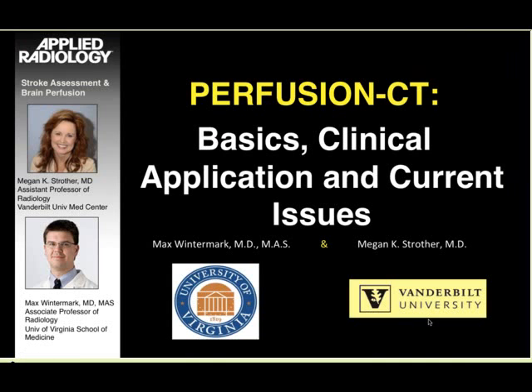There's much debate about imaging stroke. Dr. Wintermark and I could and may argue about the pros and cons of CT over MR, the reliability of perfusion software, or the parameters which should best guide treatment. Ongoing and future trials are needed to answer these important questions. However, I hope the radiologists listening to this webinar won't wait to start perfusion until all of these questions are clear. For me, CT perfusion is like being handed a treasure map with an X marking the spot. I use the perfusion studies to first evaluate in stroke. I start with the perfusion studies, then look at the CTA studies to find the occluded vessel. The perfusion studies save time in my assessment of strokes.